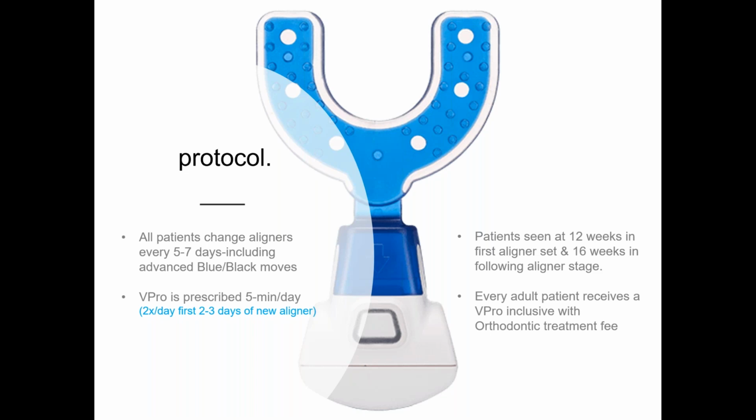Well, how about seeing that now you have great systems available with Invisalign virtual care, that if you don't have to do any IPR, you can track these patients virtually. They don't want to come to your office, especially now. We're eligible to get the vaccine hopefully in another week or two, but they won't be getting the vaccine for maybe 6 months from now. They still don't want to come to the office. So if we can track these patients virtually, how great is it if we know that the predictability of the aligner is going to be up to 90%, knowing that they're using VPRO at the same time.